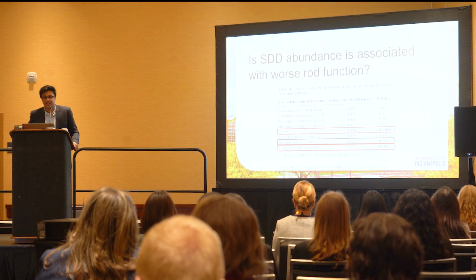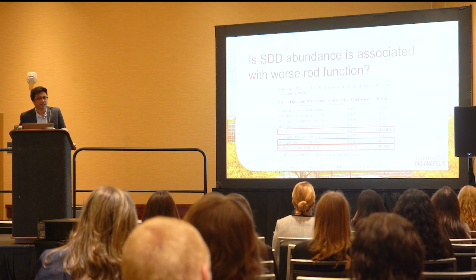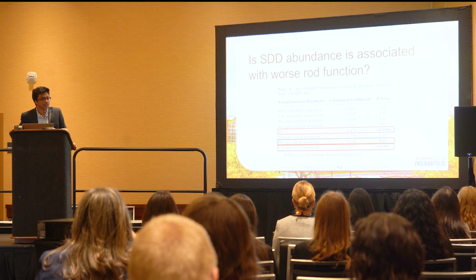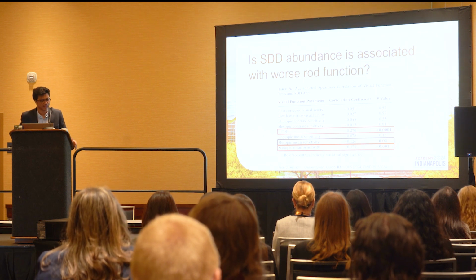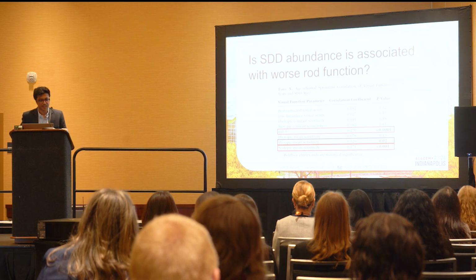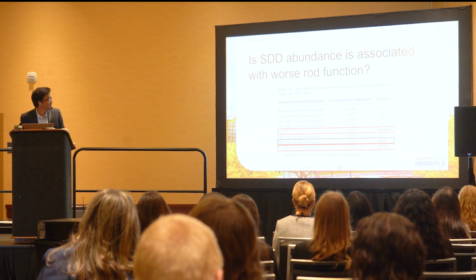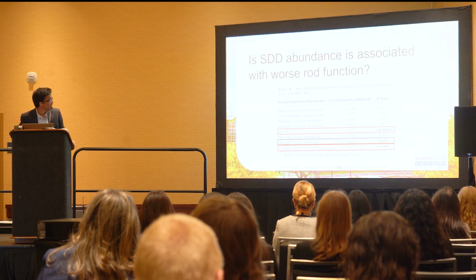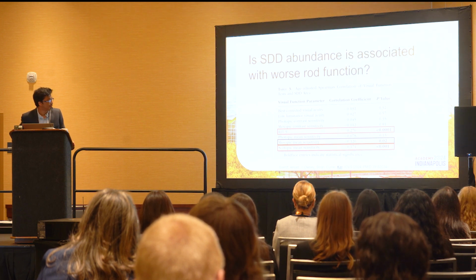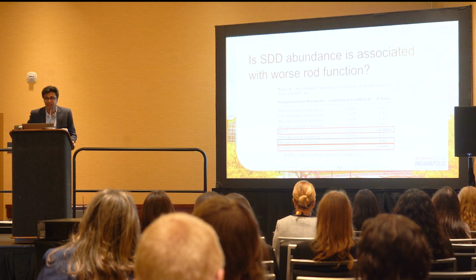So how are these deposits related to visual function? Now, we looked at a battery of tests in ALSTAR2, which included rod, cone, and mixed rod and cone responses, so in the scotopic, mesopic, and photopic conditions. And we found that the rod intercept time using dark adaptation, scotopic mean sensitivity using microperimetry, and mesopic mean sensitivity using microperimetry again, were significantly associated with the area and the burden of SDD.